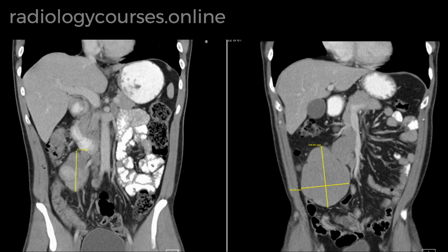If you think it is difficult to calculate, or you have already forgotten this basic arithmetic because you are now a radiology registrar or a radiology consultant and you don't have time to do that mathematics, what you can do is write these measurements in the report, such as: the nodal mass measured so and so in its AP, transverse and craniocaudal axis in the first scan, and currently it measures so and so in its AP, transverse and craniocaudal axis on the current scan.